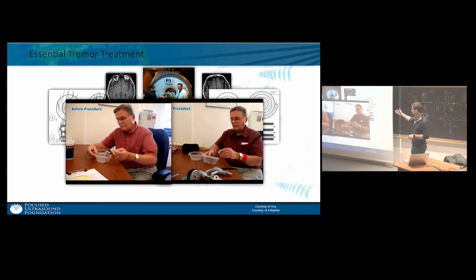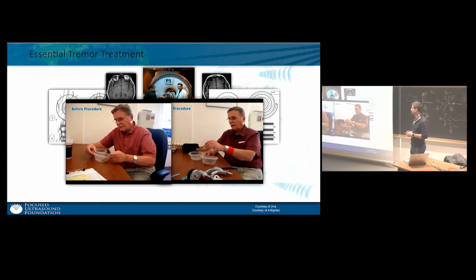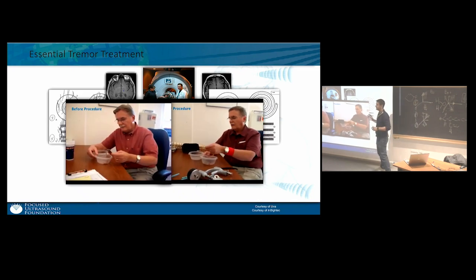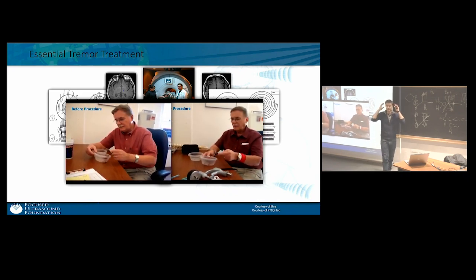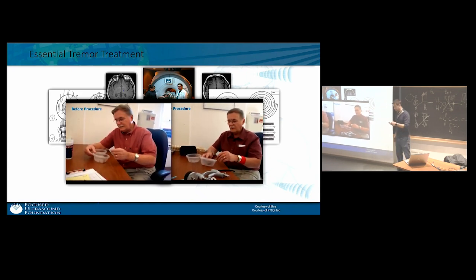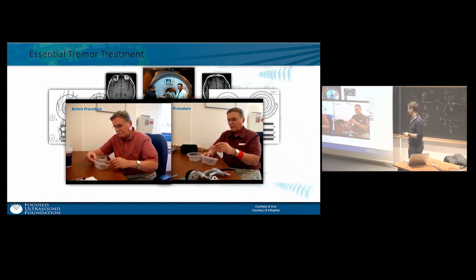This is a video a few months after. This is a single treatment shot. And this happened a few months after, and now he's able to translate the ball without any problem. And I can tell you this is a few months after because the patient was shaved during the procedure, so no hair, because this is essential for ultrasound coupling. And you can see that it works after only one treatment, and that this treatment was able to be efficient for months and years.